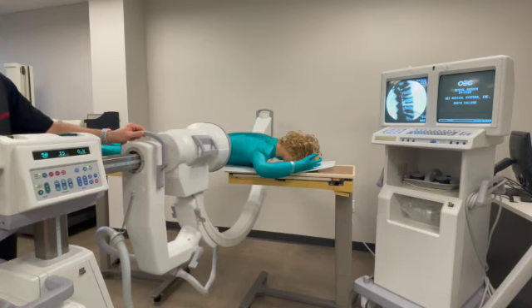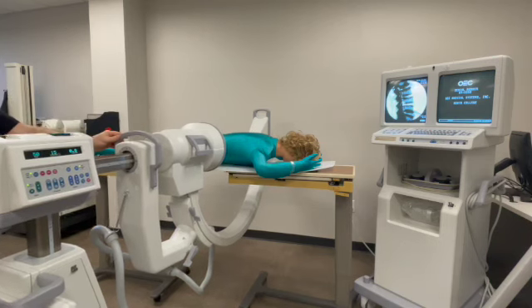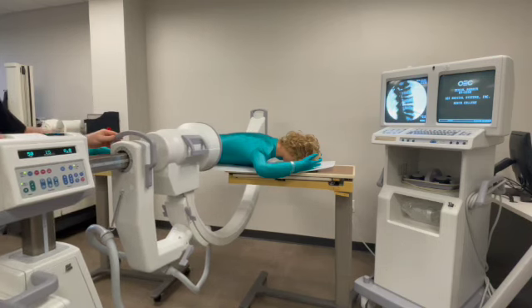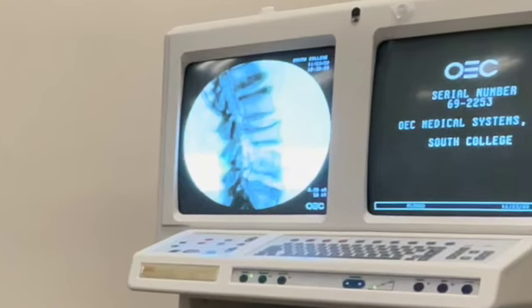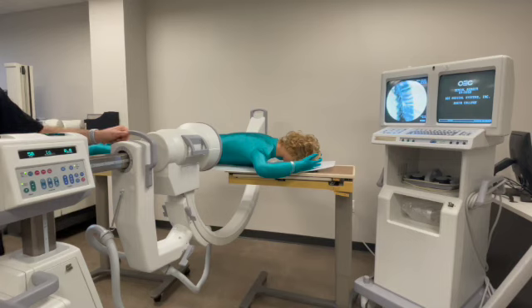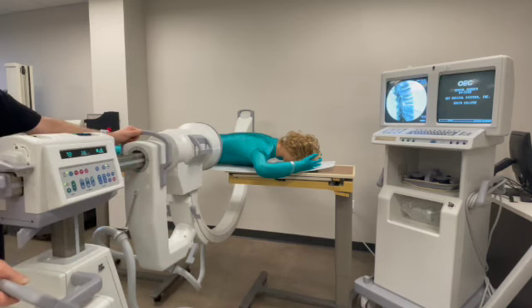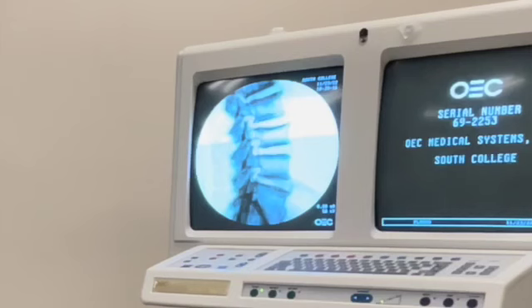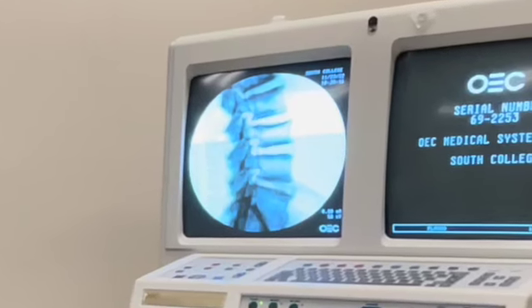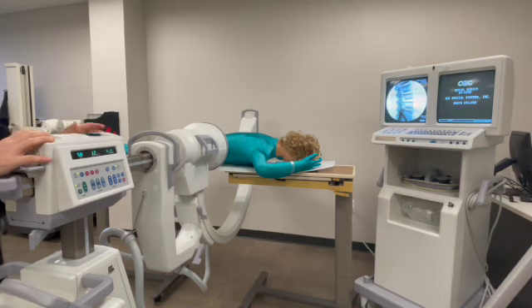So I'll wag into the head here. When you wag, you have to bring the machine back down to maintain your centering. When I shoot here, that would look worse. If you're able to think in the moment, you can assess that as being worse. But remember, you have a physician who's getting more and more irate because every time they just hear that button, they hear radiation. Now we've got our wag correct — but that's three exposures to get to where we need.